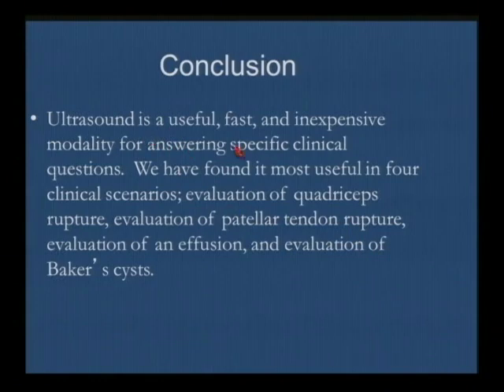So, in conclusion, we think ultrasound's useful, fast, and it's an inexpensive modality for answering specific clinical questions. So we're not saying all cases that are done with MR should be done with ultrasound or vice versa. But there are certain clinical scenarios where it's very helpful. We've found it most useful in 4 settings: evaluation of the quadriceps tendon rupture, evaluation of patella tendon rupture, evaluation of an effusion, and evaluation of Baker's cyst.